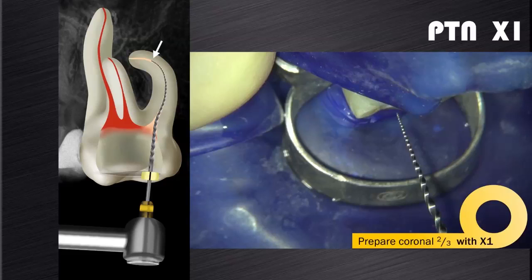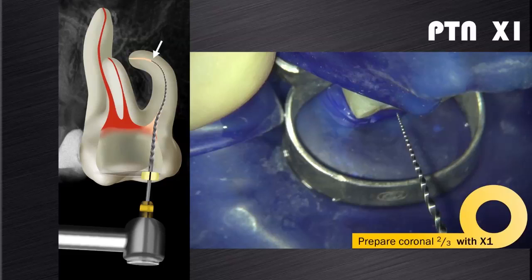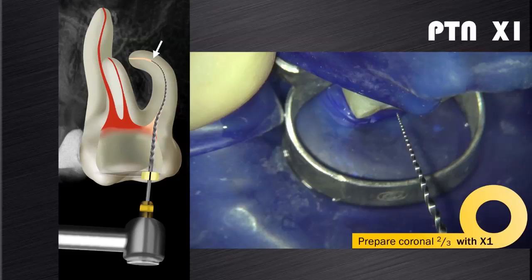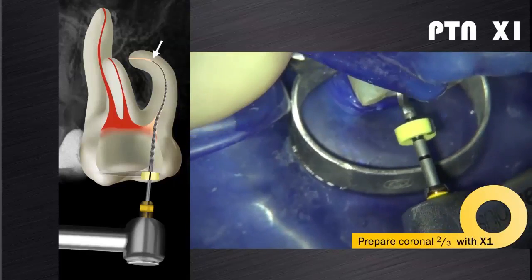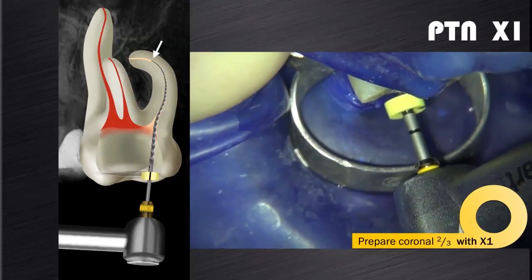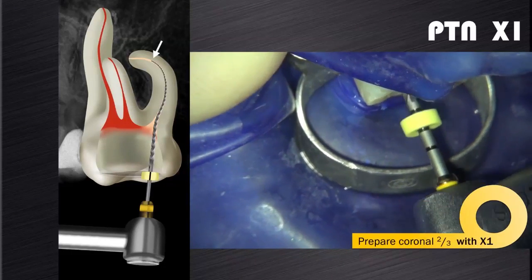In some cases you might find that the ProTaper Next X1 progresses as normal down the complex canal, but in some cases you will feel from the tactile feedback, despite the coronal brushing motions, that the file still hangs up and does not really want to progress. On this video you can see that I introduced the X1, brushed my way down for a few millimeters, but then experienced complete resistance and I could feel that the instrument takes a lot of strain.